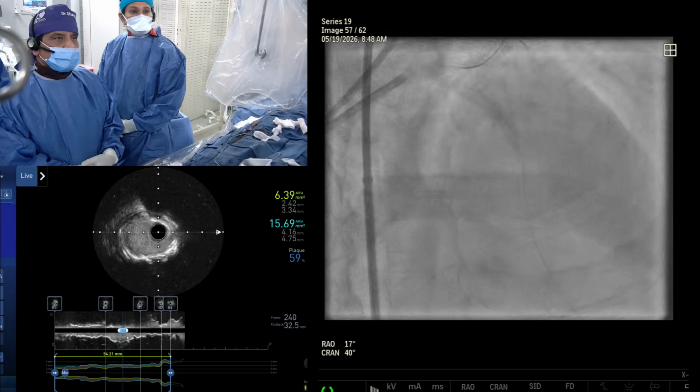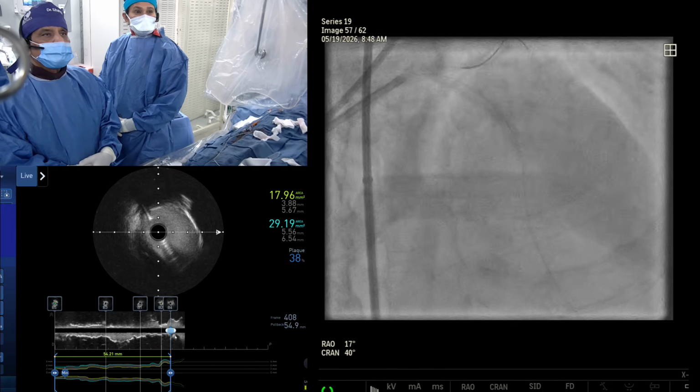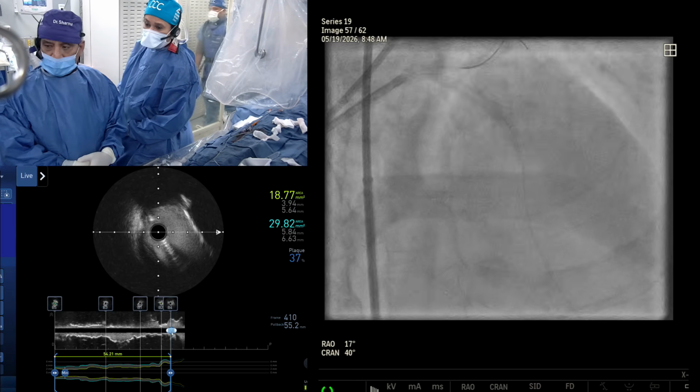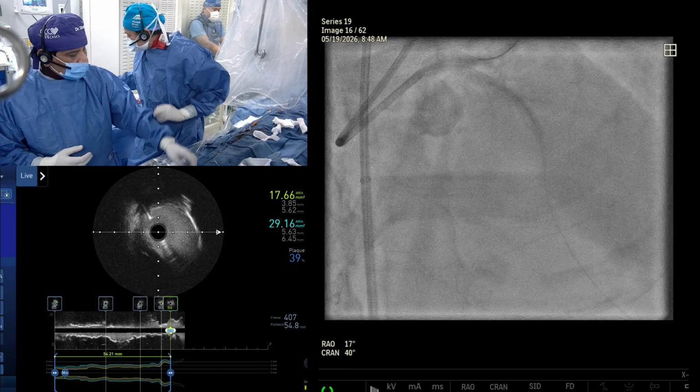Yeah, exactly. But the proximal LAD is like a 3.9 vessel, and the left main is more than 4 vessel. It's a huge size gap. So you want to go low pressure, 3.5 or 3.0, and high pressure? I would go 3.0. Okay, yeah, 3.0 please. That's okay. Give us a 3.0 by 48.